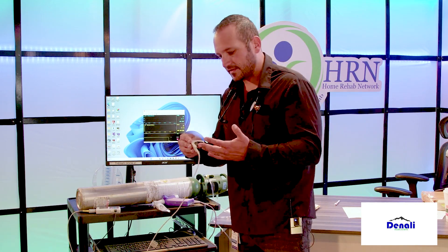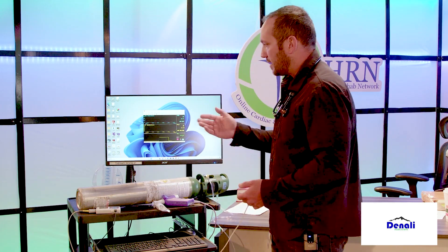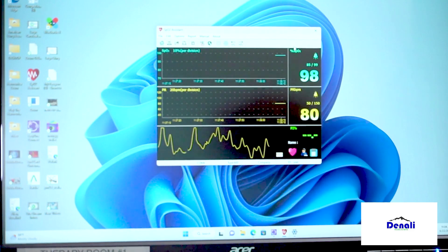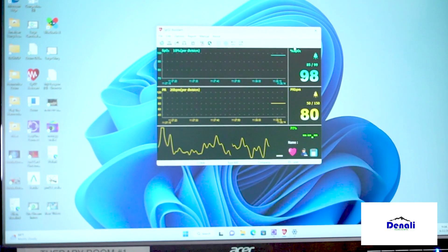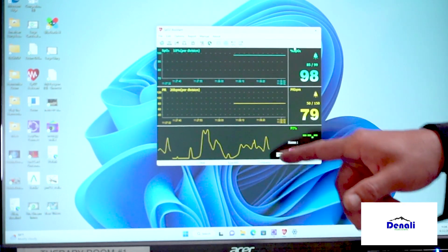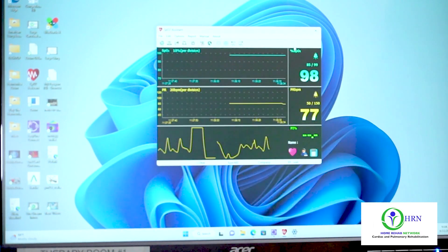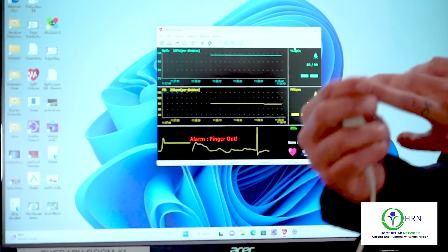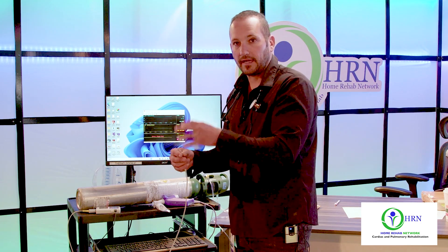I'm going to put my pulse oximeter onto my finger and look at the saturations. The first reading is not correct until after 30 seconds — even though those may be great numbers, we have to look at this from a clinical perspective. What's the best finger to use? The ring finger is the most vascular finger, so if you want an accurate reading, use the ring finger.